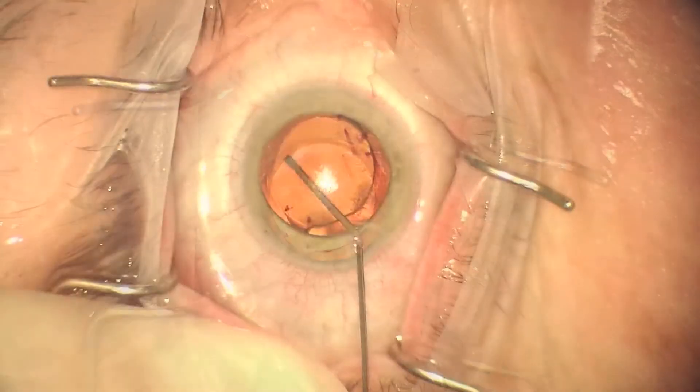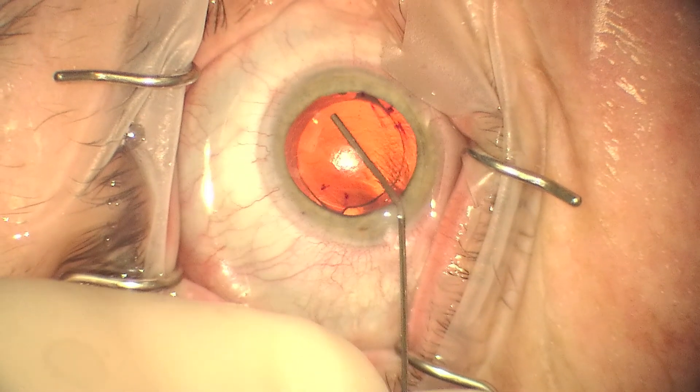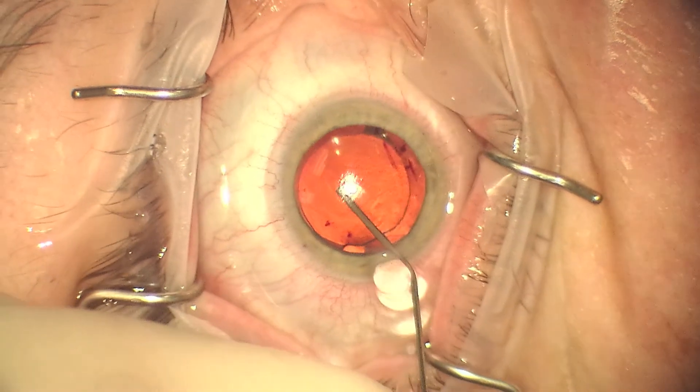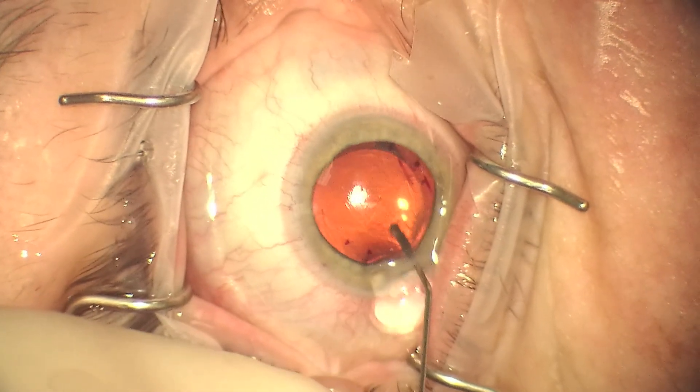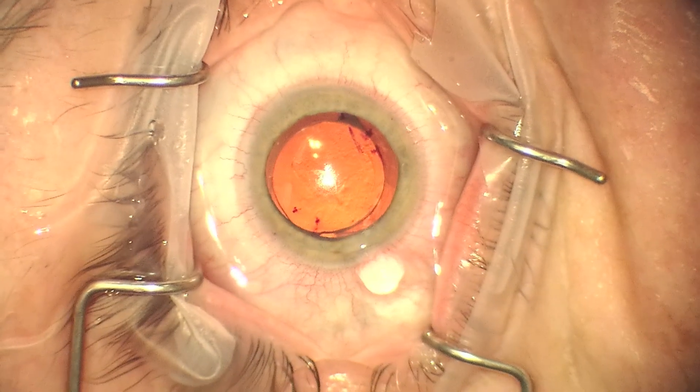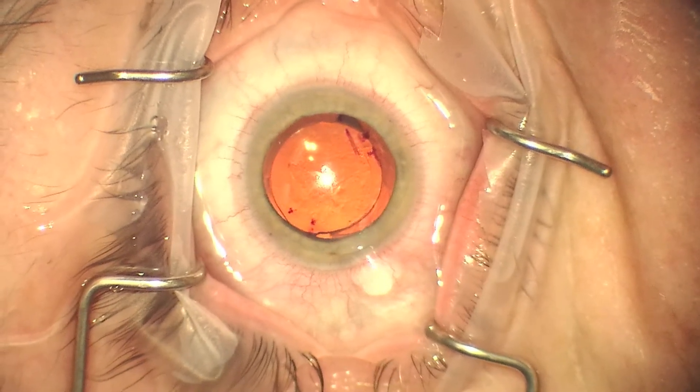One thing that's nice about marking the current position and where you're going to rotate to is that you don't have to take into account the effects of cyclorotation. Clearly you would have to when you originally implant the IOL, but not once it's in place.